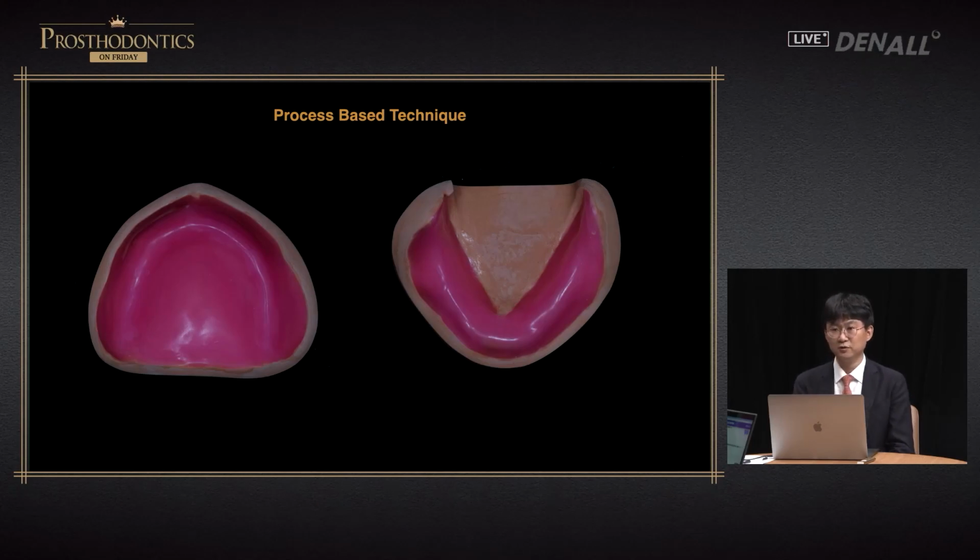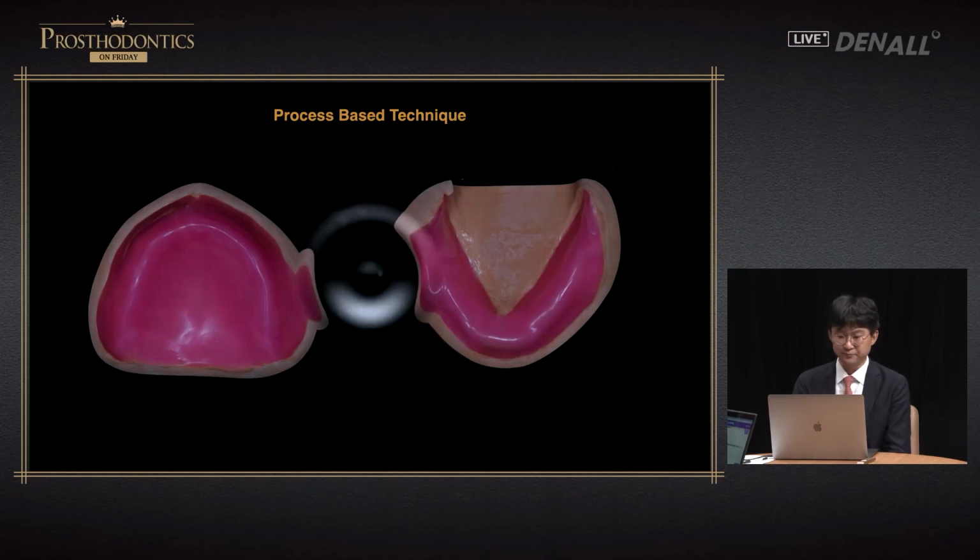I saw many dentists doing this when I visited the United States. However, it has a problem of double curing. I don't use this technique often, but when the base is stable with this technique, the adjustment you have to make in the final position is considerably reduced, which is an advantage.